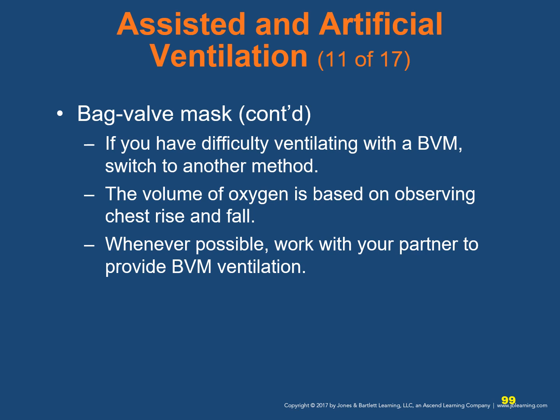The BVM components are a disposable self-refilling bag with no pop-off valve or a disabled pop-off valve, a non-rebreathing outlet valve, an oxygen reservoir that allows for use of high concentration oxygen, a one-way no-jam inlet valve with a flow of up to 15 liters per minute, and a transparent face mask. It offers the capacity of performing under extreme heat or cold conditions. The total volume for adults that it provides is 1,200 to 1,600 milliliters. Pediatric is 500 to 700 milliliters. Infants are 150 to 240 milliliters.